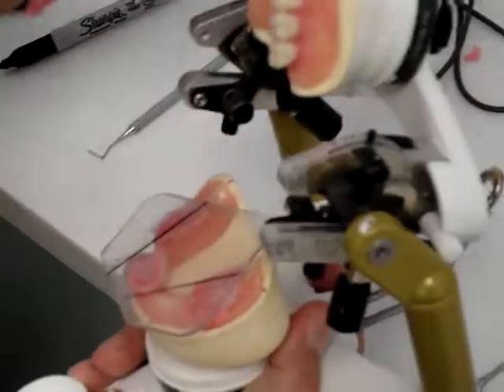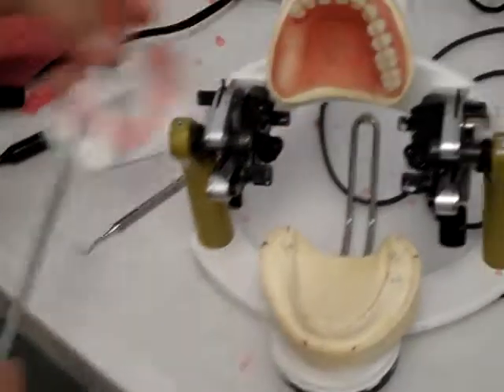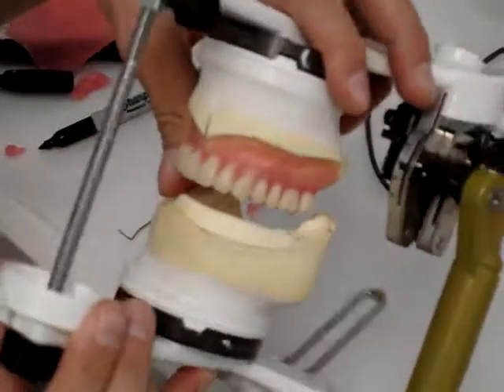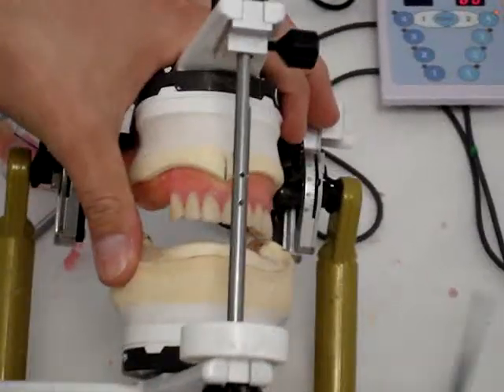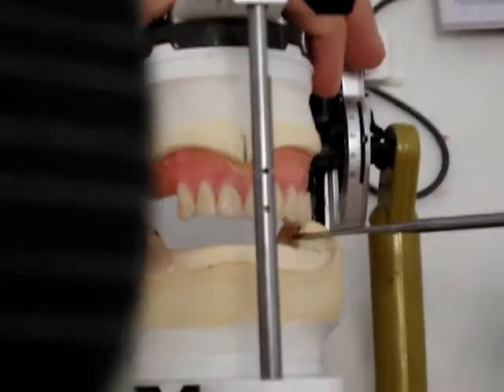So what I do is, you take this off, because the whole reason we draw this line is to make sure that we're on ridge here. So another thing you can do is take that off and just check and make sure that these teeth are on line with this ridge.